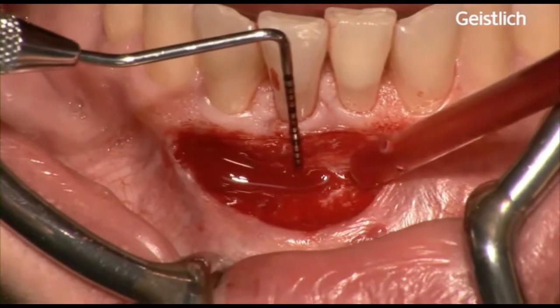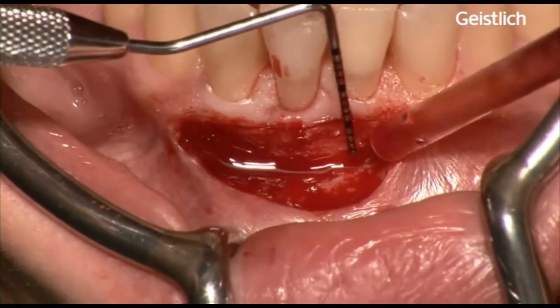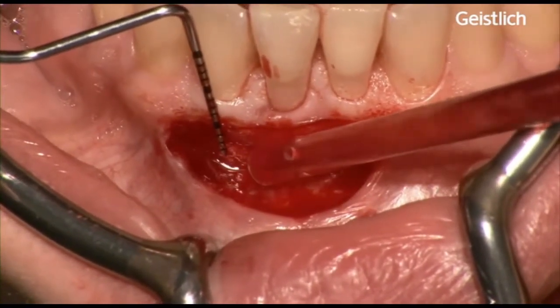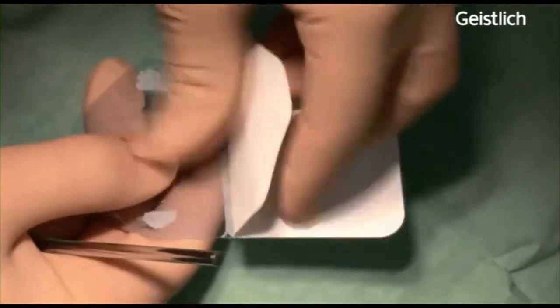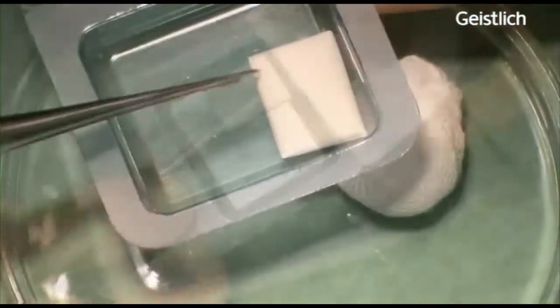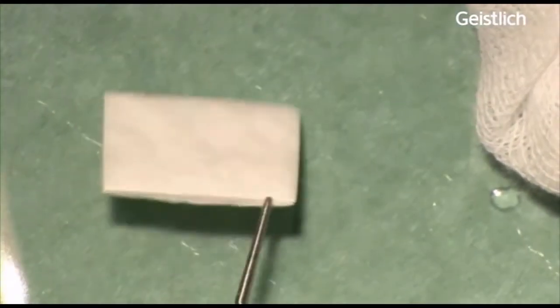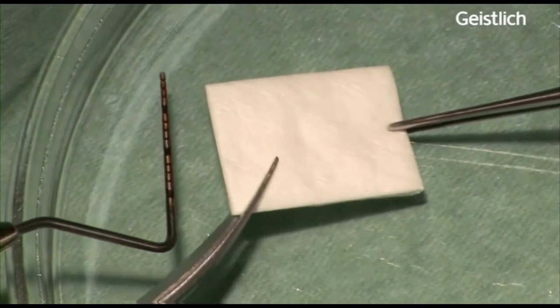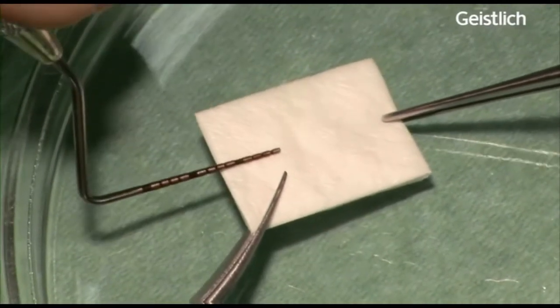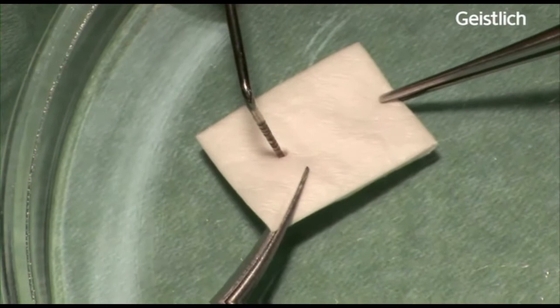Precise trimming of mucograft is important to avoid tension when suturing the device. The sterile double-packed mucograft package is opened, the matrix transferred to a sterile tray and trimmed to the appropriate size in dry state. Mucograft is a three-dimensional collagen matrix of porcine origin serving as a soft tissue substitute. Using this surgical technique, we are expecting to obtain a clinically sufficient width of newly formed keratinized gingiva. It is also expected to achieve an aesthetic outcome, less patient morbidity and less costs compared to the treatment with a free connective tissue graft.